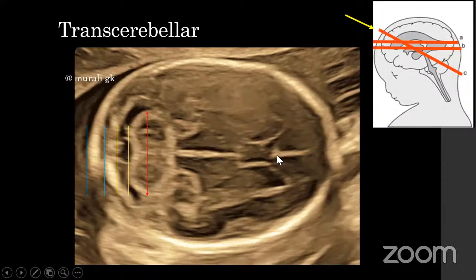You are again seeing the anterior falx interrupted by the cavum septum pellucidum. An important clue to tell you are at the level of CSP is that it's always flanked laterally by the frontal horn of the lateral ventricle. So in all three axial sections, one important structure which is always seen is the cavum septum pellucidum. You need to appreciate it, as it serves as a marker to avoid erroneous measurements, erroneous sections, and so forth.